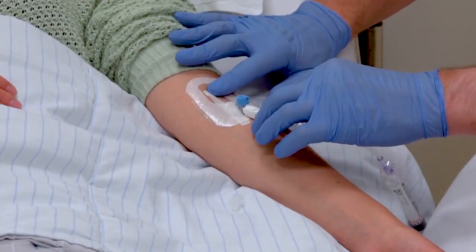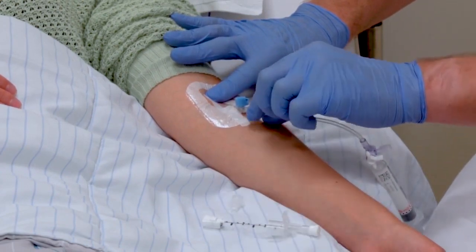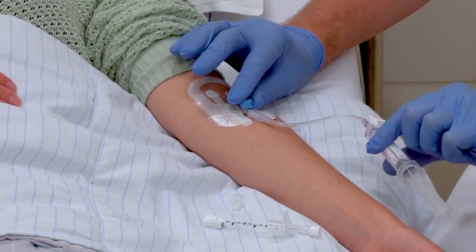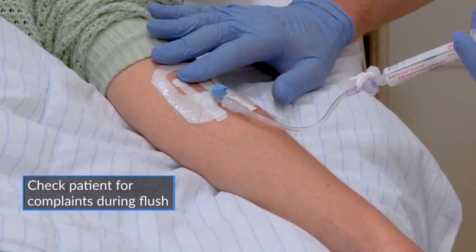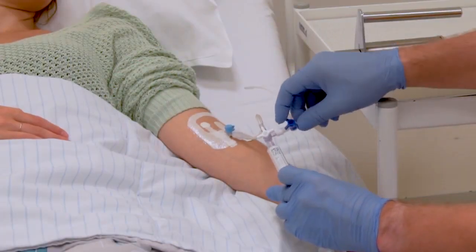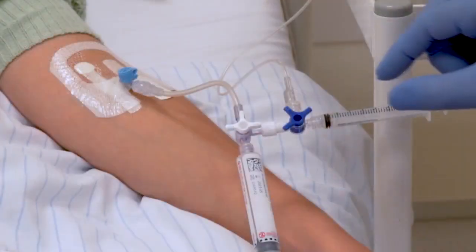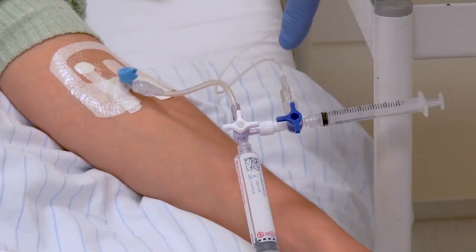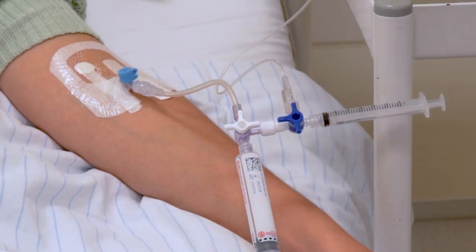De-aerate the stopcock with saline and attach the stopcock to the venous cannula. Check the patency of the cannula with 10ml of saline and attach the syringe with the radiotracer to the three-way stopcock. Then turn the valves of the three-way stopcock such that the direction of the fluid will flow from the syringe containing the radiotracer to the peripheral venous cannula.